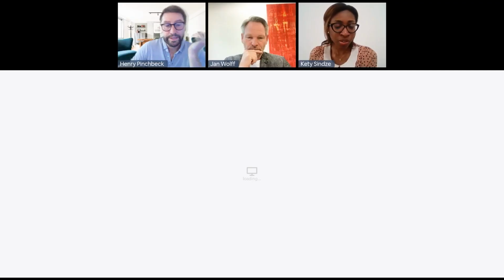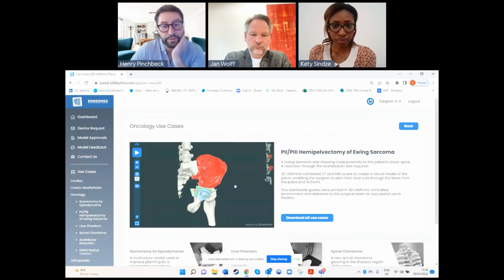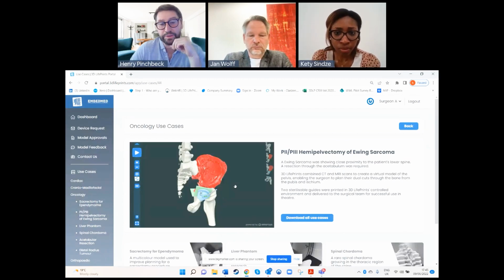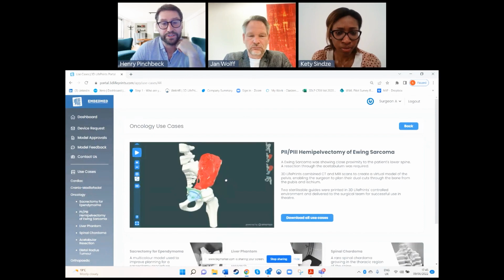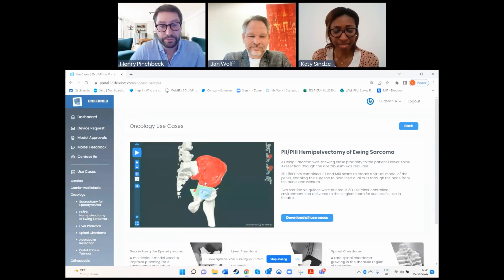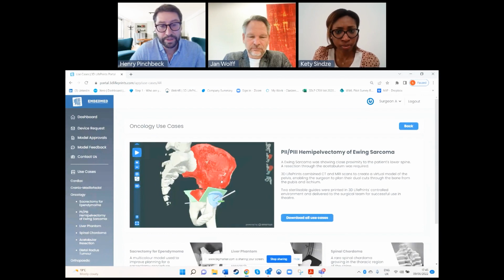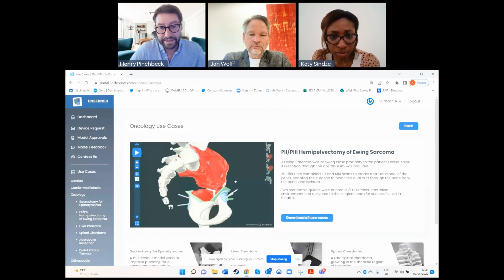And those who are listening to us can also enlarge your screen in order to see what Henry is going to show us. Okay, so here we've got a complex orthopedic surgery case, and in traditional surgeon speak, this probably means nothing at all to Jan because he's a craniofacial surgeon. Hopefully he gets it though. Okay, so you can see here what we've got is a large tumor of the pelvis that's picked out in red, and you can see what the surgeon wants to do. He wants to resect the tumor.